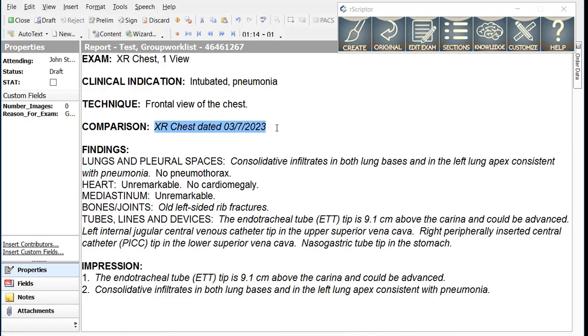Explore the many smart macros available in R-Scripter and feel free to modify or add your own using the Customize button on the R-Scripter interface.